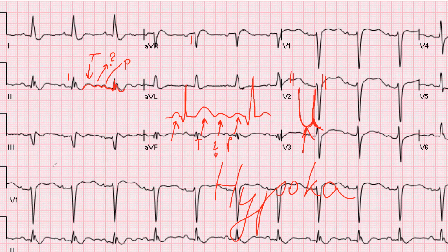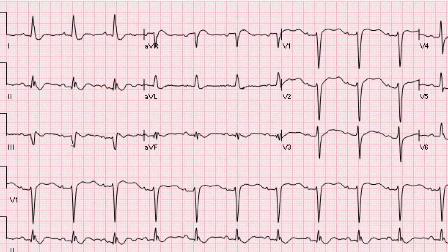Do not forget it. And in case of hypokalemia, you can have a widening of the QRS complex. That's fine. It's completely normal, and a prominent U wave. That's it. Please watch those videos.